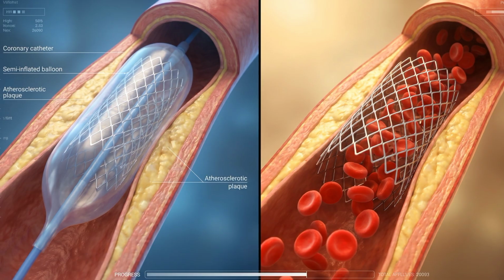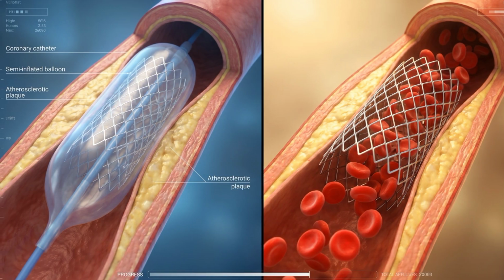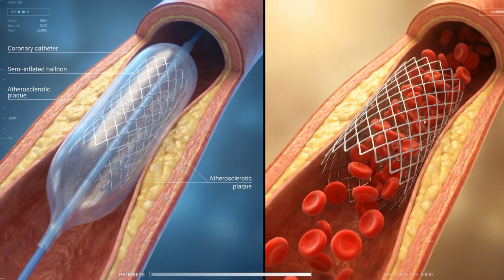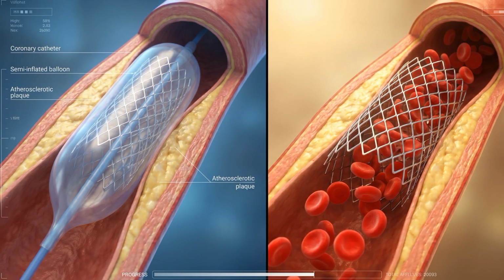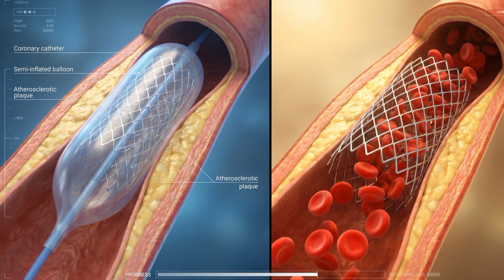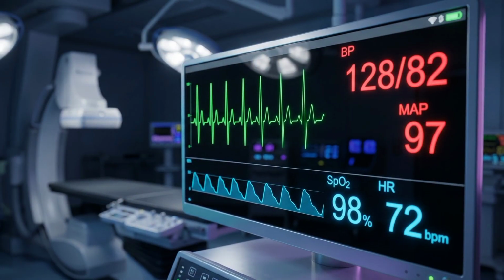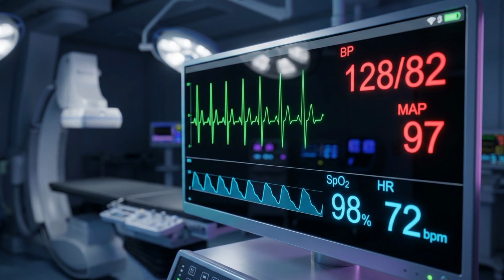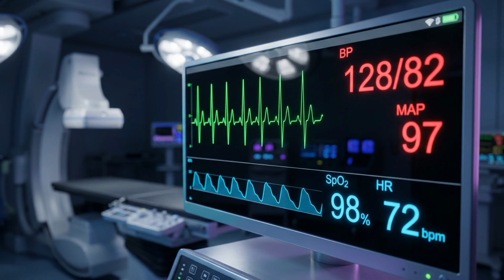What makes a cath lab so powerful is that it allows both diagnosis and treatment in the same place. During an angiography, if they diagnose a block, immediately they will do angioplasty and remove that block, opening up the blood vessels so the blood will flow properly.